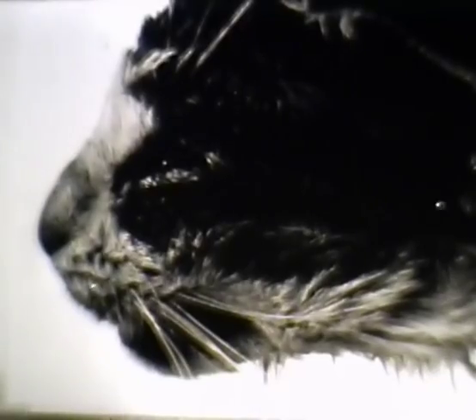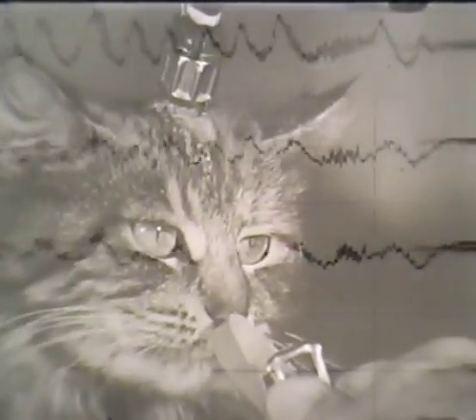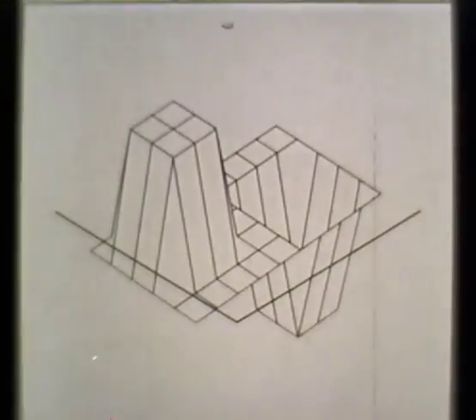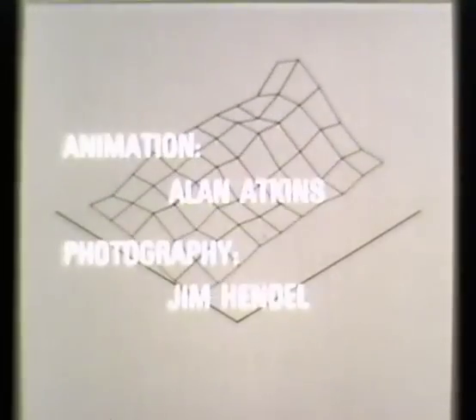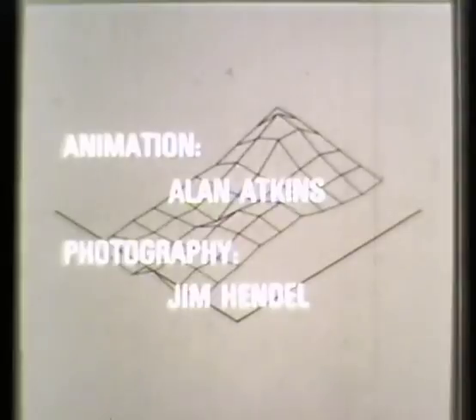The value of these techniques for spatial display of the EEG will be enhanced when the techniques have been extended to recording from waking animals. It can be anticipated that the EEG will provide two kinds of information. The first is related to the spatial distribution of neurons, which are processing particular signals, and the second is the nature of the dynamics of the interactions among neurons, which are reflected in the EEG.